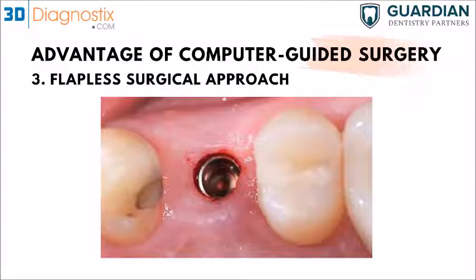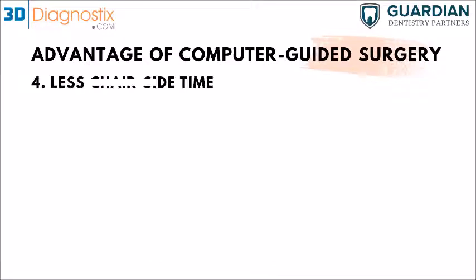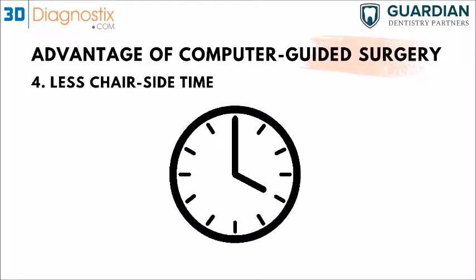So if it's far back in the molar sites, we usually tend to have the axis better. So sometimes it could be a challenge, but as long as everything is fine, the patient has good mouth opening, we can actually plan on having a flapless procedure, which would finally provide you with less chairside time. You can execute a single implant in less than 30 minutes. So that's an advantage. Of course, you can actually use your time in having multiple procedures done on the same day.